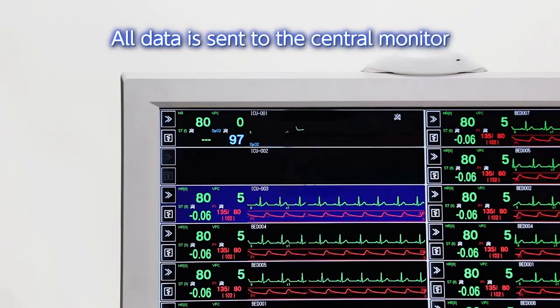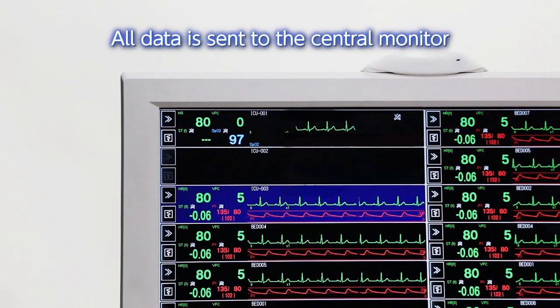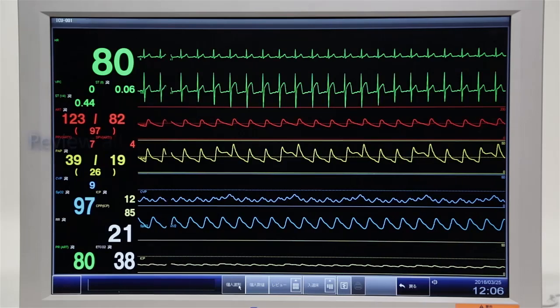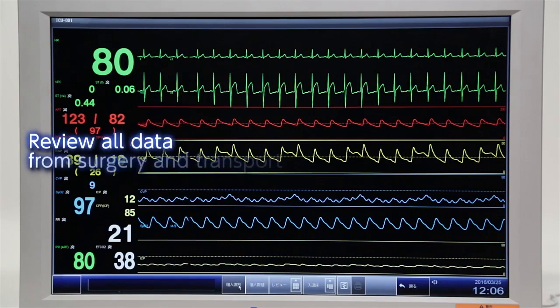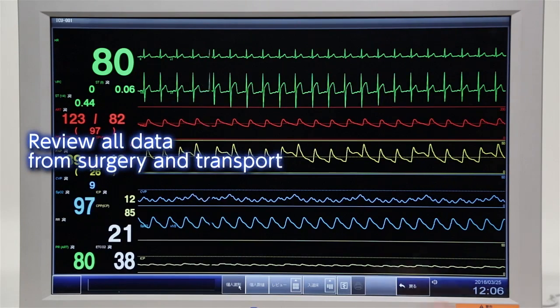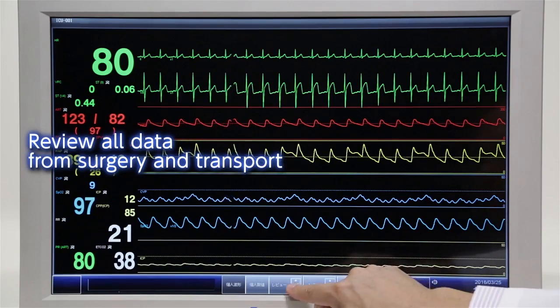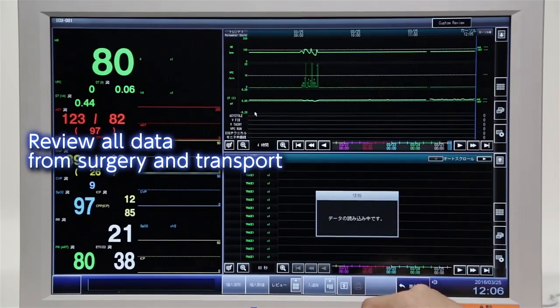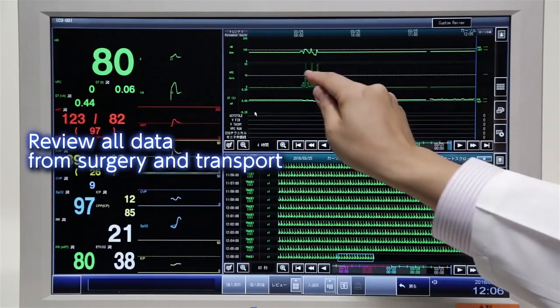A seamless flow of all data before, during and after transport is sent to the central monitor. In the ICU, you can review all the waveforms and data from surgery and transport.